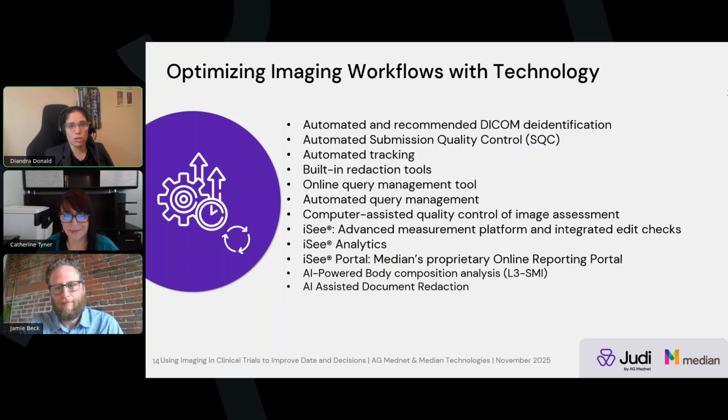Upon receipt of the images, we do check that all this information matches what is listed within the clinical database. And if there are any issues or we are missing images, for example, we received a CT image but not an MRI image, then we do query the site requesting that they submit these images, because based off of the clinical database, those are images we are expected to be receiving.